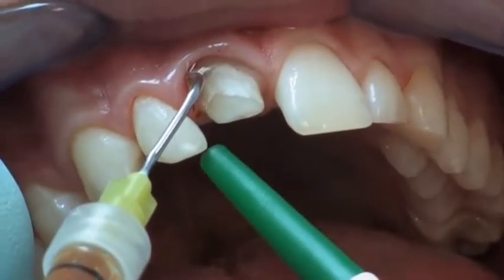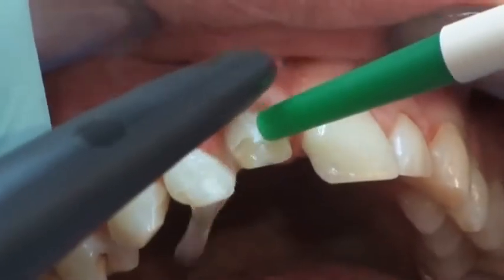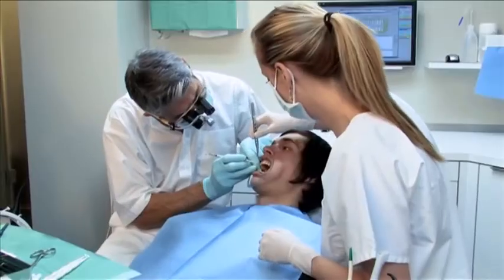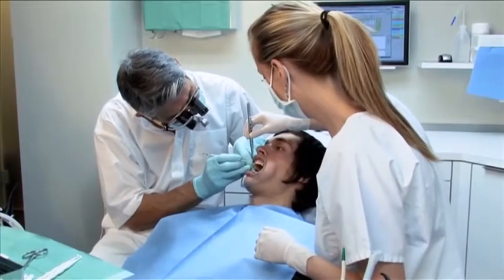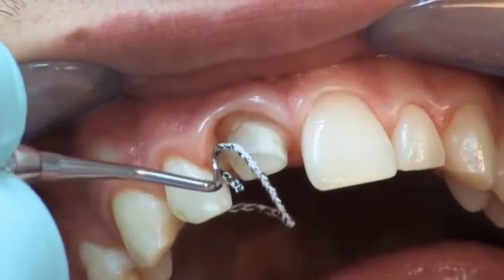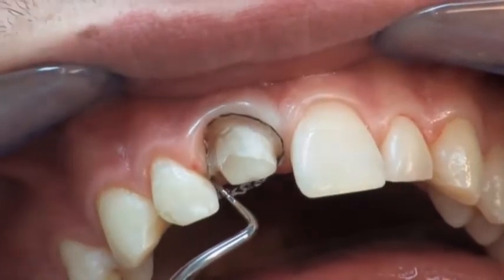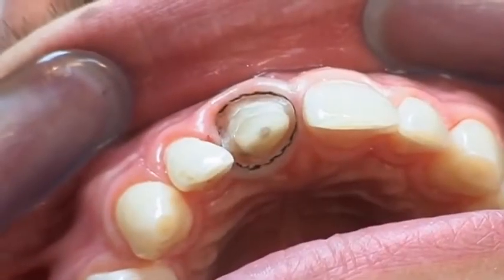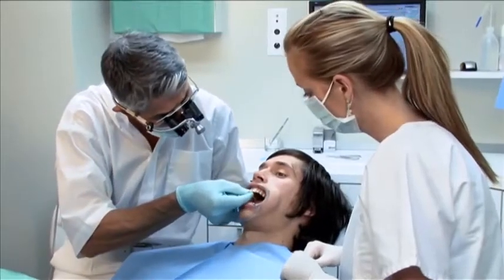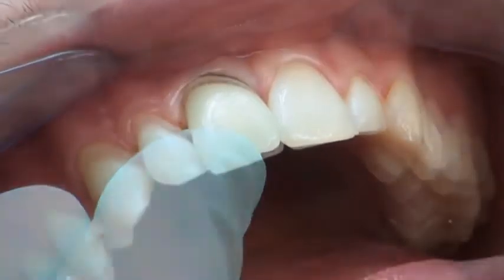For adhesive cementation of the permanent restoration, a dry working field is essential. Hemostasis can now be performed. Atraumatic compression of the gingival tissue is performed using Compracord. The fitting accuracy of the final all-ceramic crown is checked once again.